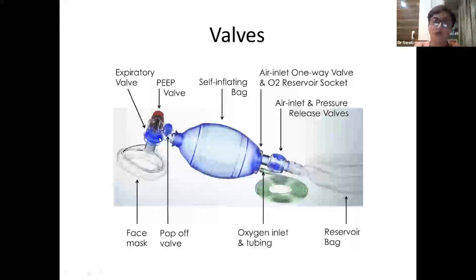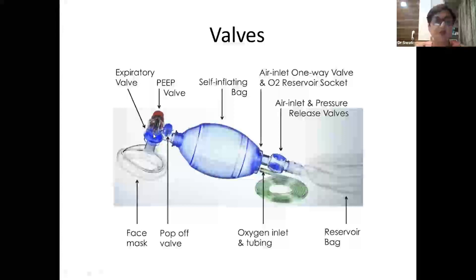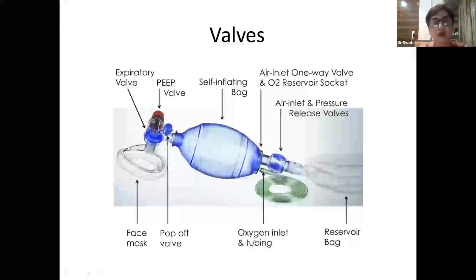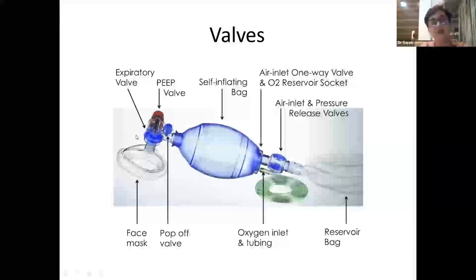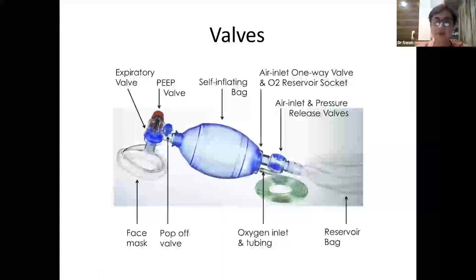At the patient end there is a fish mouth valve, visible when looking through the opening connecting to the patient. This is a one-way valve that allows only forward flow of gas toward the patient and does not allow gas to re-enter from the patient end. When the baby exhales, gas is released from the expiratory valve.